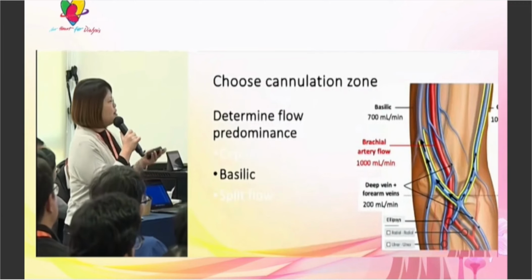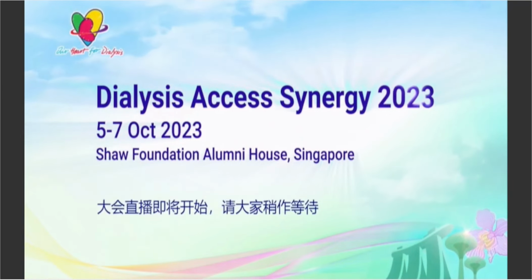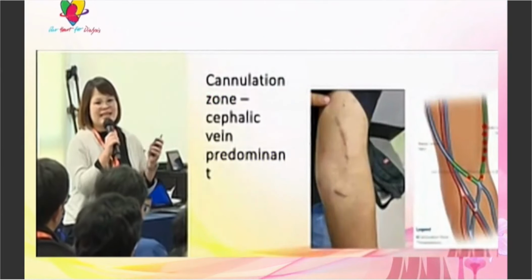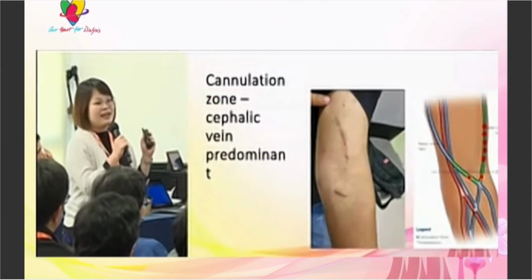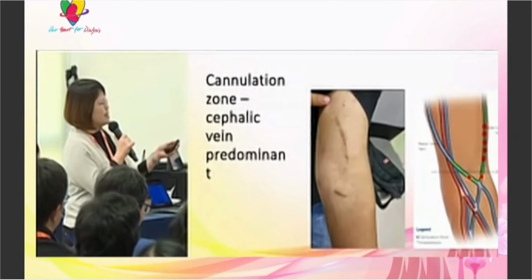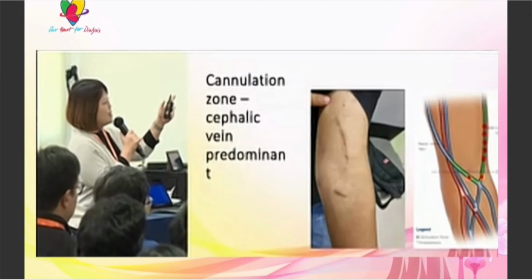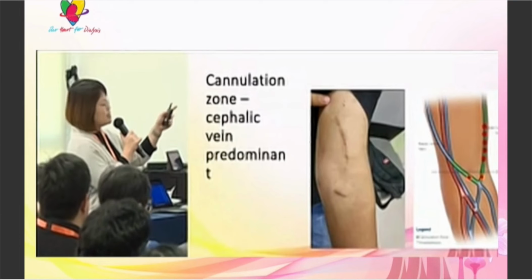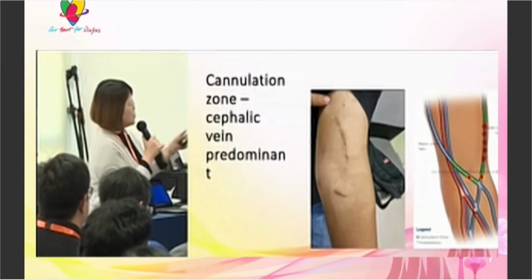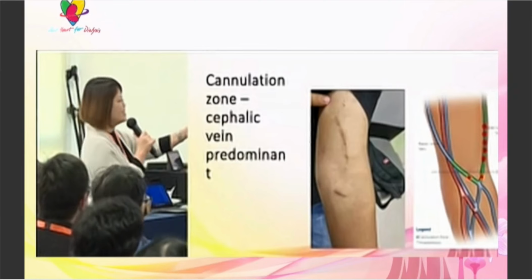The basilic one will look like something very similar to what we see, even though it's a split flow. But again, choosing between the basilic and the cephalic vein can be more visible. Hence, that's what we'll usually do, we'll mark up for them. So in this case, the upper and the lower cephalic vein of the upper arm are cannulated, and also take note that the cubital vein is also cannulated in these particular patients.